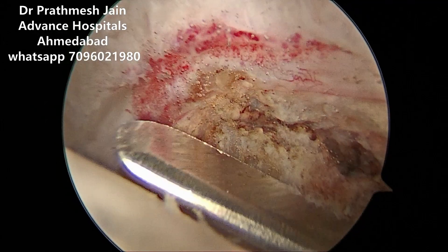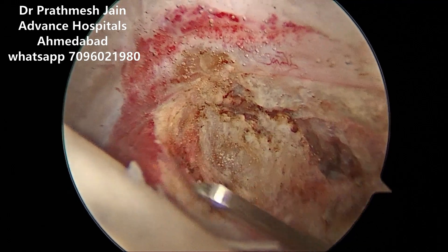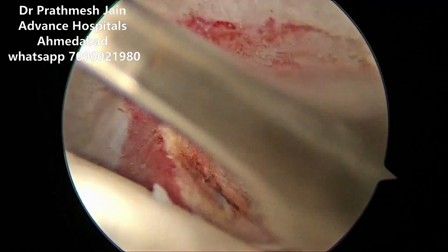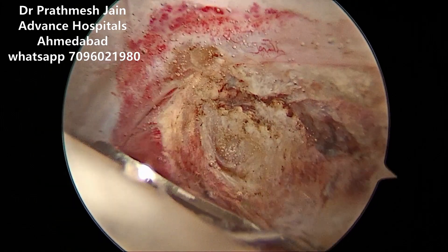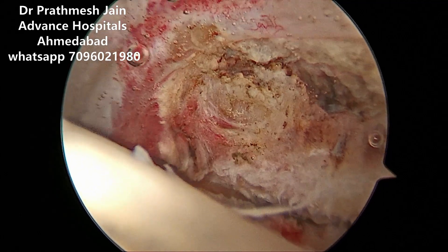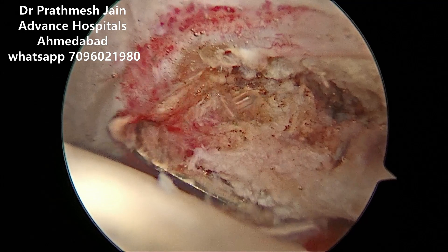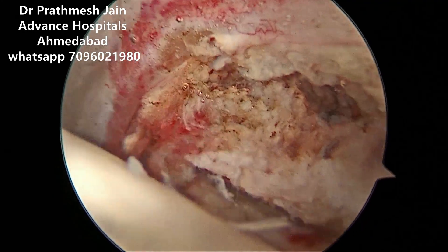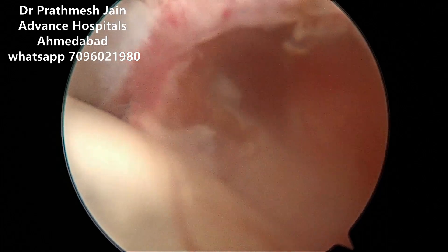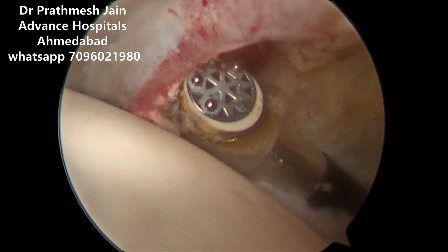This is a beaver blade, which is a very useful device to do the capsulotomy. By using it, we can do a very thorough, sharp, clean capsulotomy performed in a very nice way. Once this much of capsulotomy is done and our portals are secured, we can see that the iliopsoas can be visualized on the anterior part of the capsule.